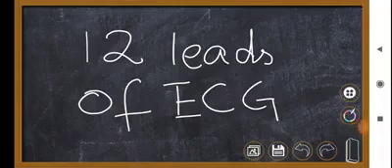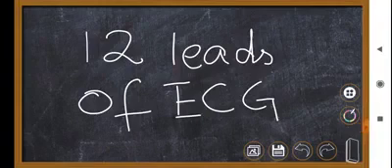Bismillahirrahmanirrahim. This video is about the 12 leads of ECG and why 12 leads are needed to conduct an electrocardiogram.